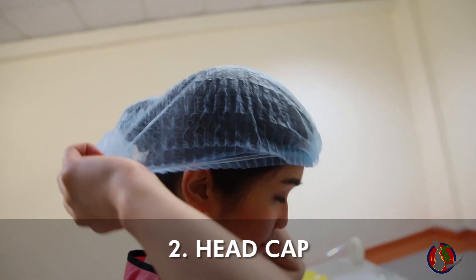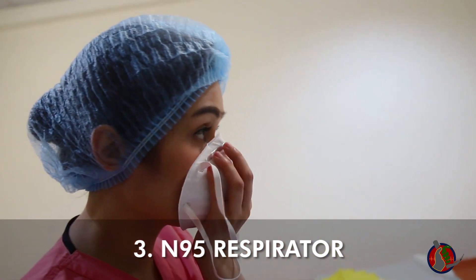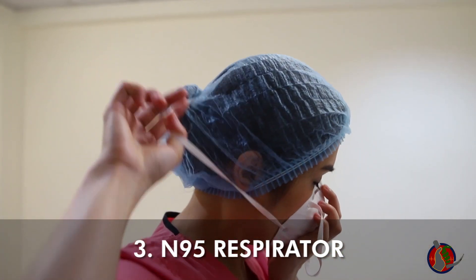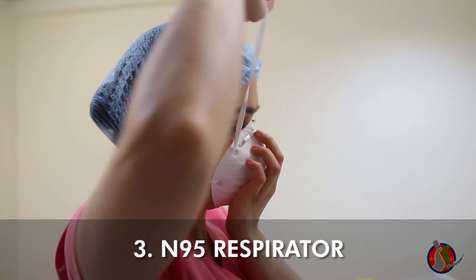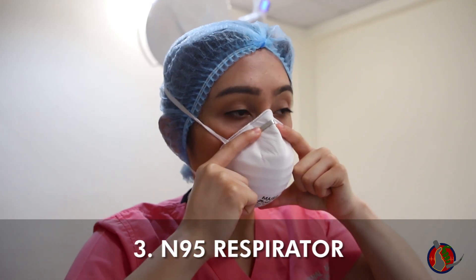Put on blue cap, making sure both ears are covered. Put on N95: cup mask onto palm and put on. The lower strap should be first and positioned just slightly below the ears. Follow with the upper strap and position over the occipital bun. Mold at the nose and check for air leaks.